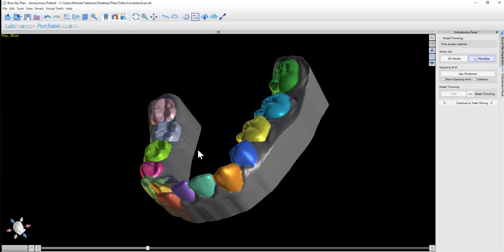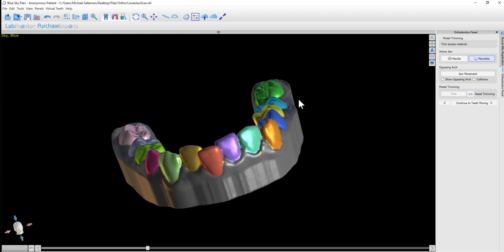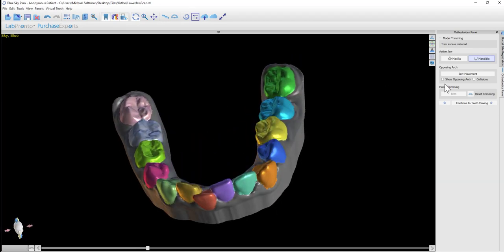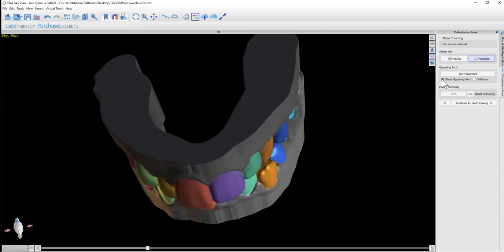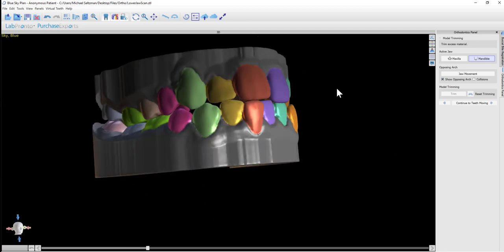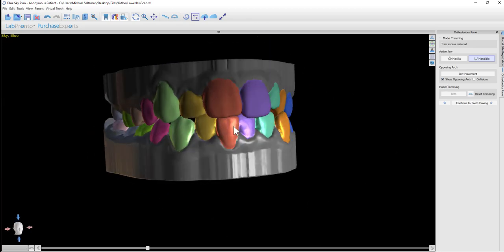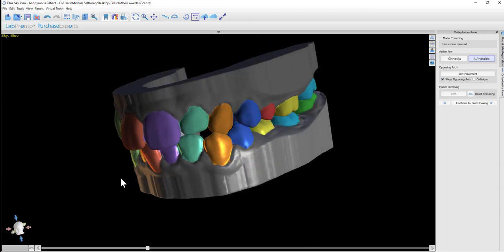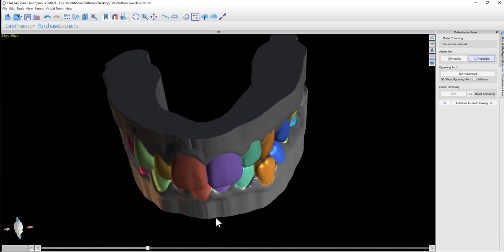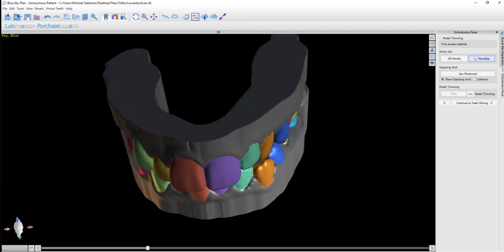We now have our mandibular arch trimmed, and we can see both arches with teeth segmented and the models trimmed and cleaned up.